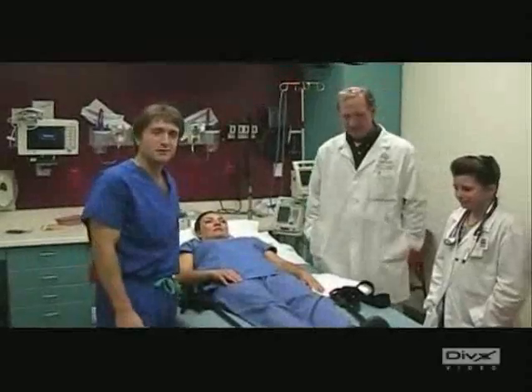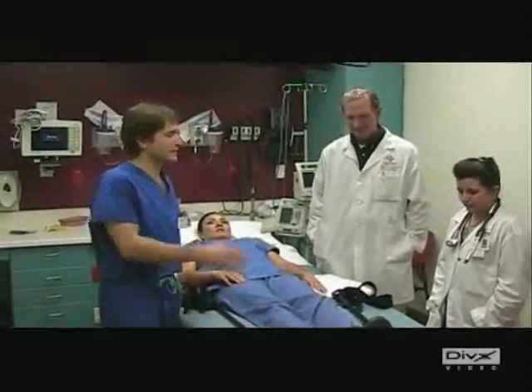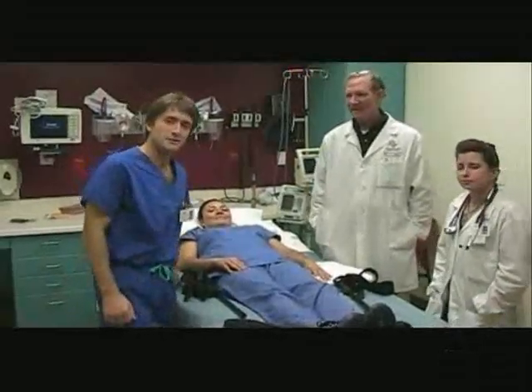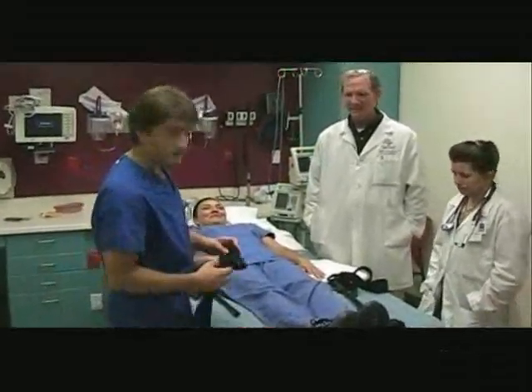Hello, I'm Sam Slishman in the Heart Hospital Emergency Department with a few of my colleagues — Sherry Minoletti, Robert McDevitt, and Yvonne Metzger — and I'm going to demonstrate use of a new type of traction splint.